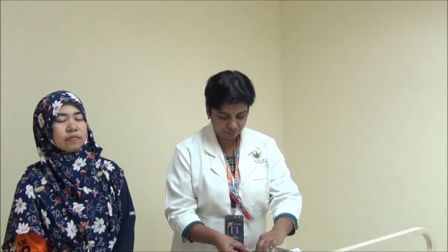And as for the needle, you should not touch the tip of the needle. I would like to stress, there are two types of needles available in the hospitals. Both these needles are 26 gauge, which are used for subcutaneous injection. However, they come in two different sizes.